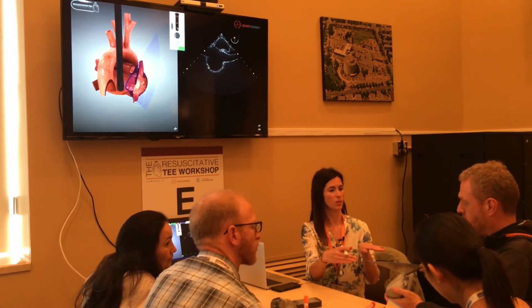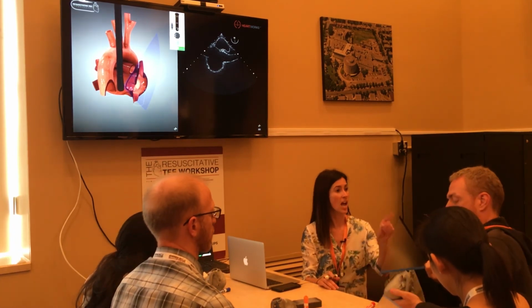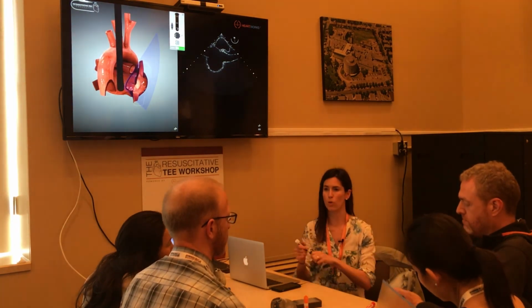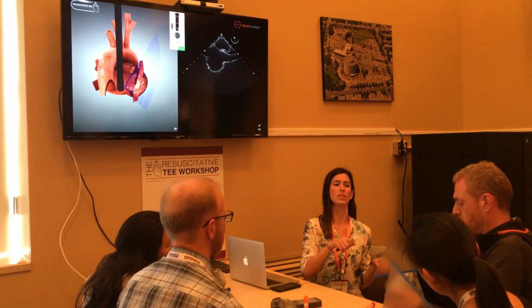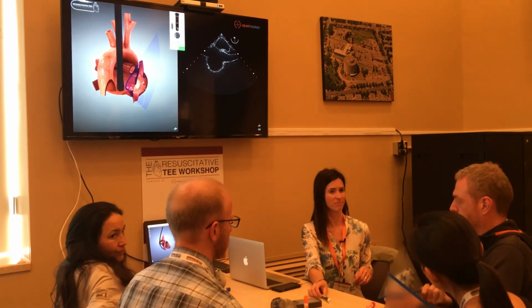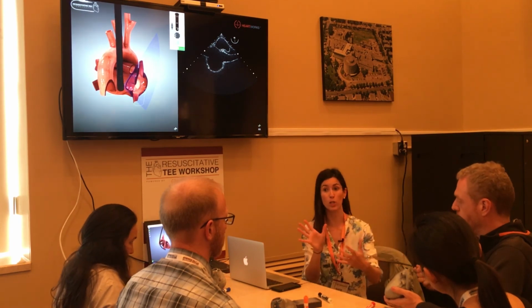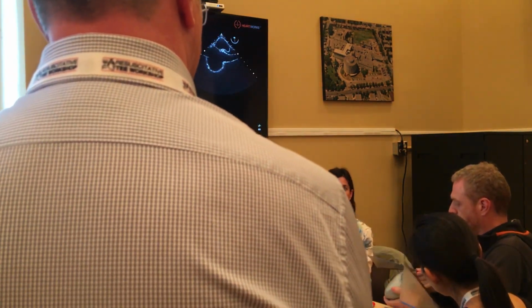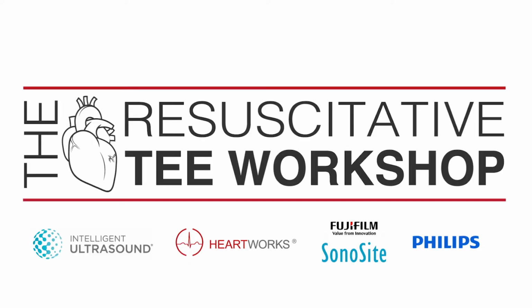All right, folks, we're going to rotate around to our next stations for the 12 o'clock times. Group one, you're going to the left to Station C, and rotating down, Group two, you're going to Station D. Group three, you're going to the same thing. So it's a similar movement to that bicaval view: rotating, turning, and then withdrawing or advancing to get higher or lower on that vessel. Great. Okay, thanks guys.